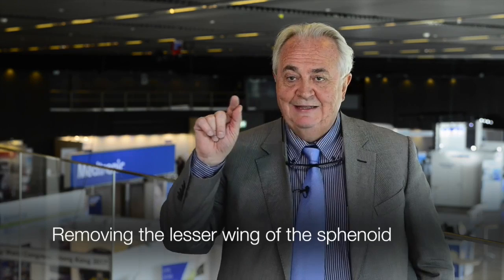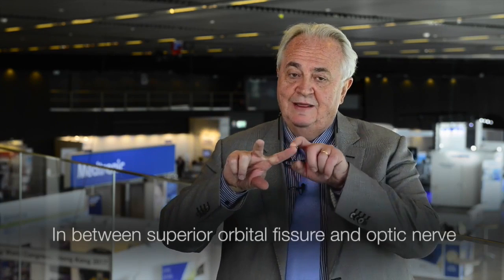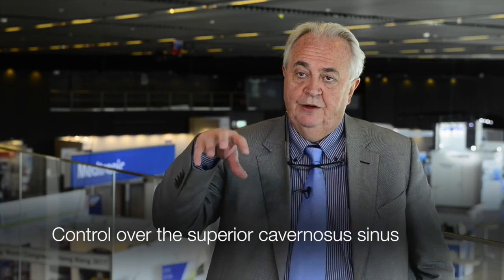Removing the greater wing of the sphenoid, we have access to the middle cranial fossa, to the floor. If we remove the lesser wing of the sphenoid, which is in between the superior orbital fissure and the optic nerve, we get control of the superior portion of the cavernous sinus.